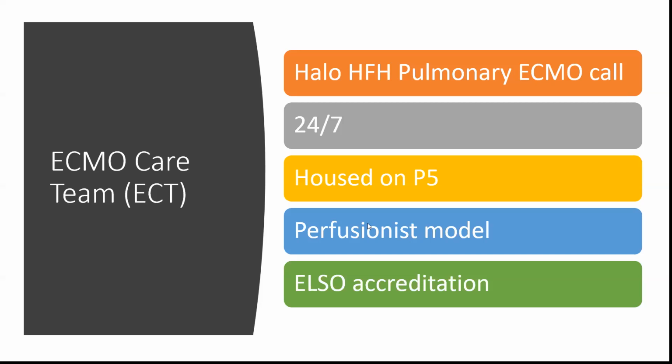There are different models for ECMO. You can have respiratory therapy, nursing. We here have a perfusionist model, meaning the perfusionists make changes and things like that to the ECMO unit. And we've submitted our application for ELSO accreditation, and we're in the process of obtaining that. That process can generally take a couple of years. It's just data gathering, and part of what we're doing right now is didactic sessions, education, and then reviewing our patient outcomes.